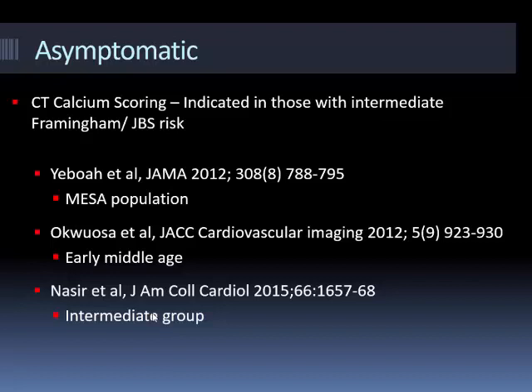And what they then demonstrated was you could sub-select this group further by doing a calcium score. In those with a calcium score of 0, you can potentially carry on avoiding statins, whereas those with a high calcium score of non-zero would benefit from more aggressive therapy. So in other words, it helps you rationalize your therapy. But clearly, if somebody's high risk, they're high risk, and the calcium score arguably is not going to add much more to their management because you're going to be treating them aggressively anyway.